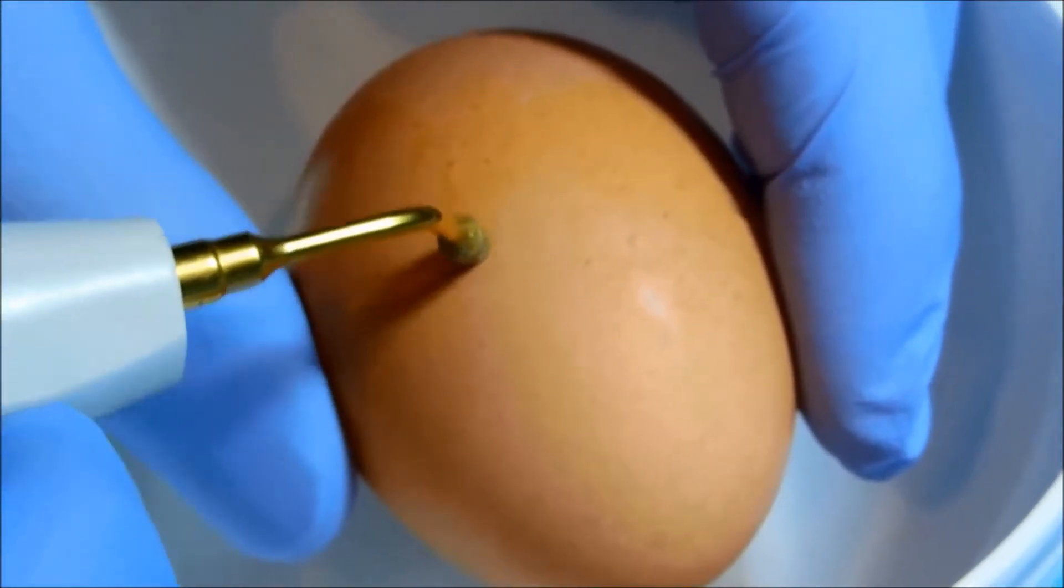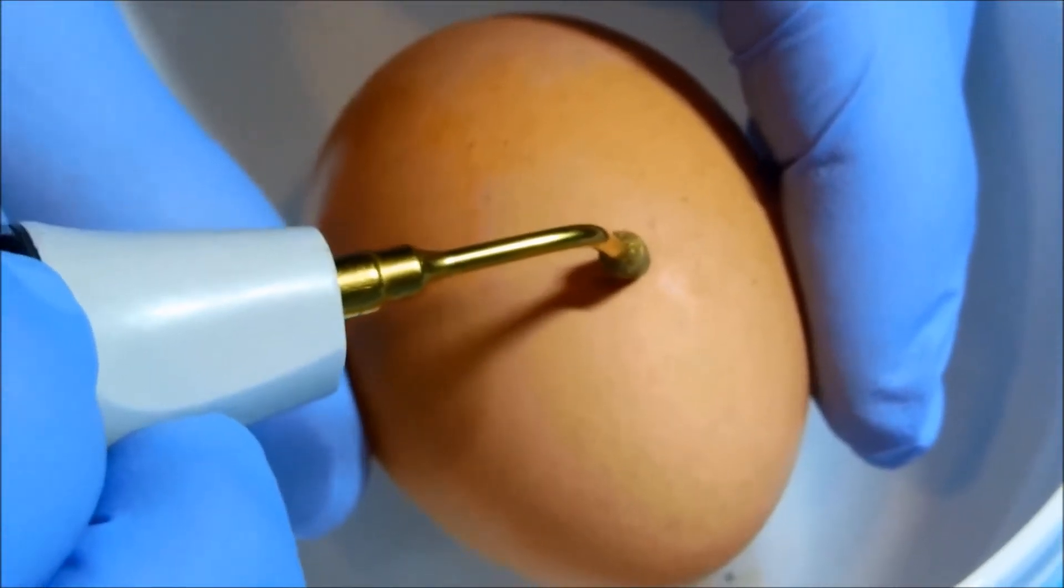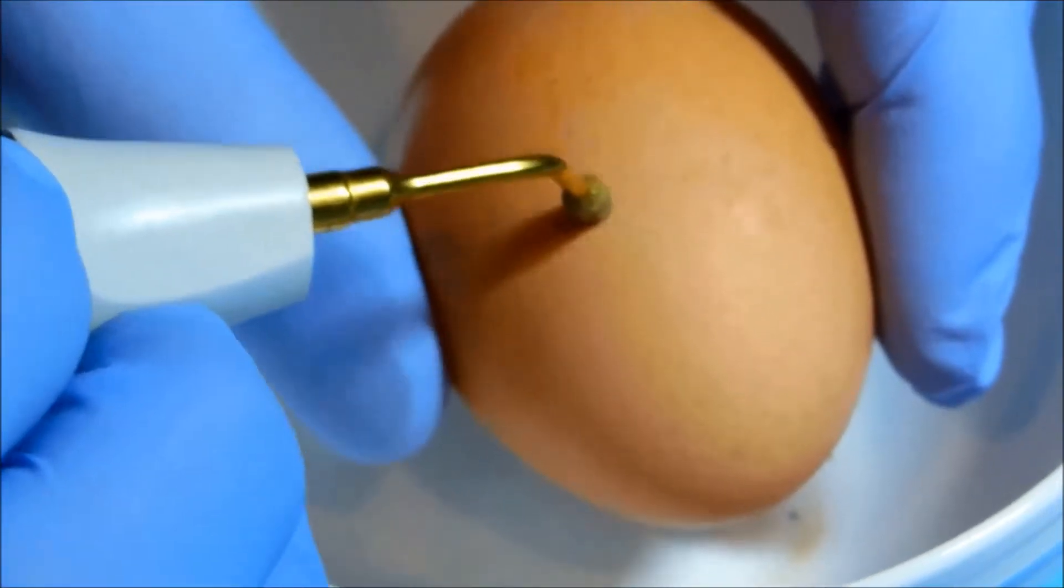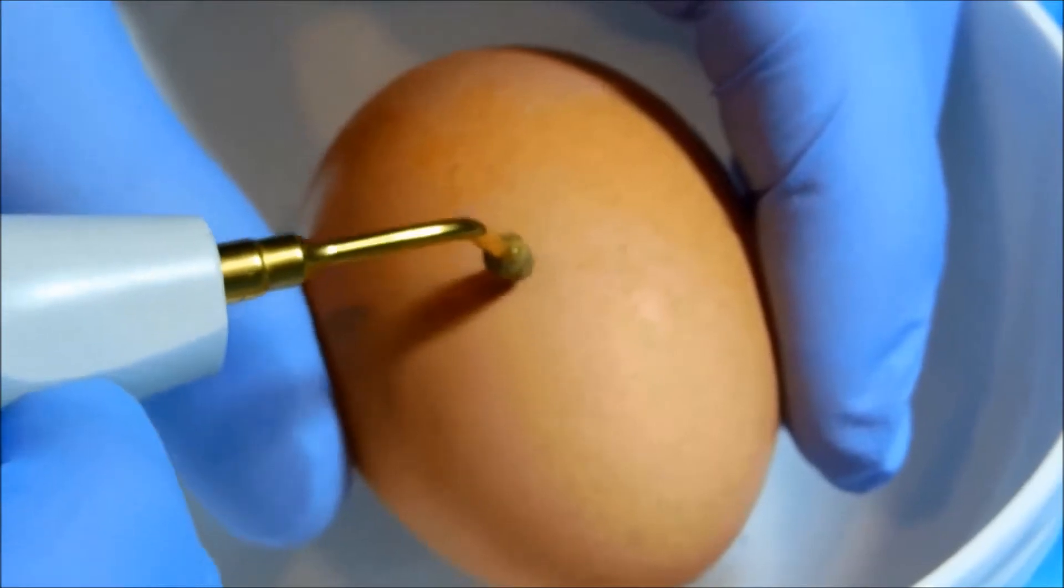This mimics removal of the bone around the sinus as we prepare the sinus for the sinus elevation procedure.